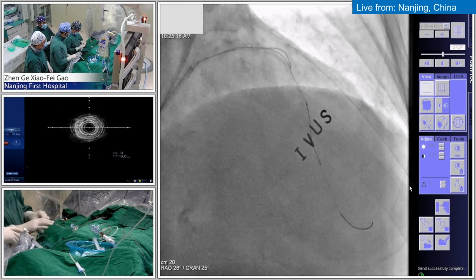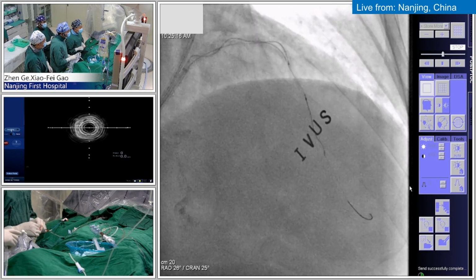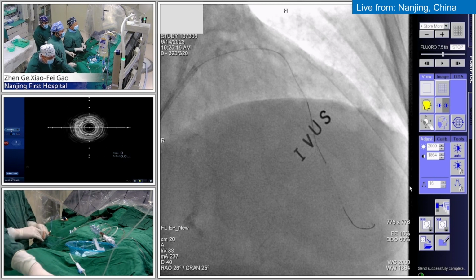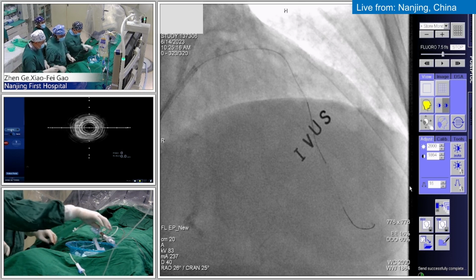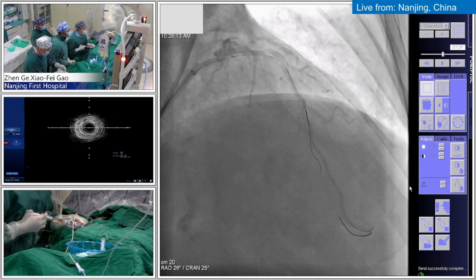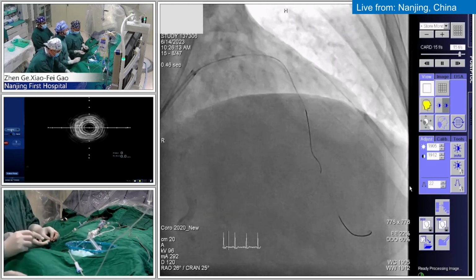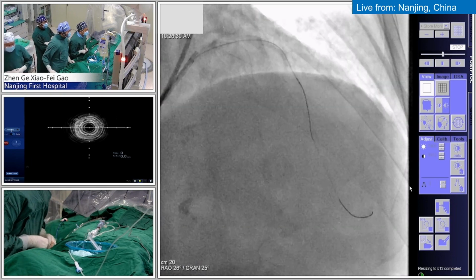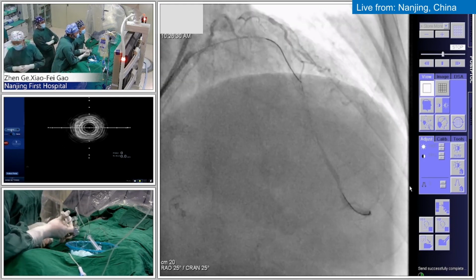But the thing is the catheter is soft. It does not cross. Probably remove it. It's not tracking. I think you need to make a decision independent of that. Let's maybe have another angiogram and then try to make a decision. It's very nice. Probably we can try the stenting. Before that, I move this wire into the diagonal.